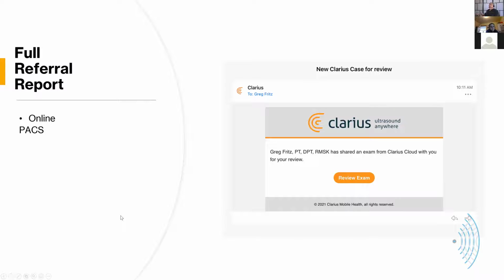So, talking to you, my referral sources or individuals who would be able to use EchoHealth imaging, studies like I've just done show just one component of what we take a look at when we're doing a full shoulder scan. And after a full shoulder scan is complete, you will have access to PACS, or an imaging assessment device, online.